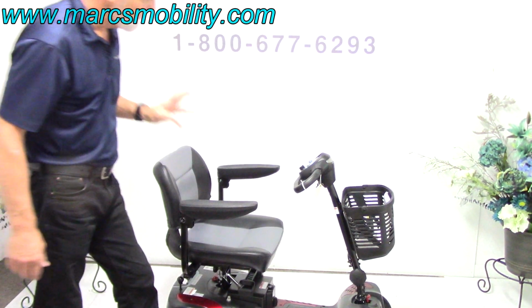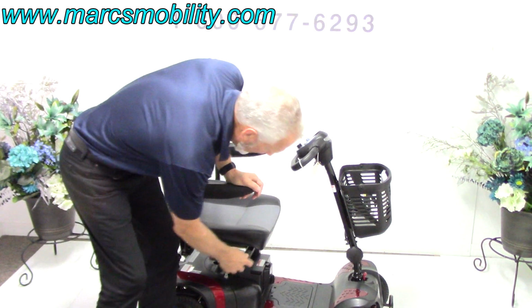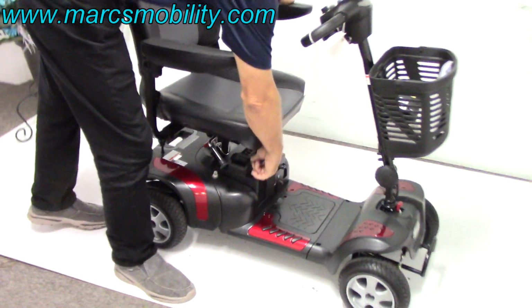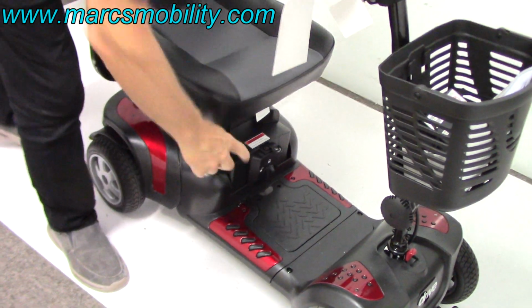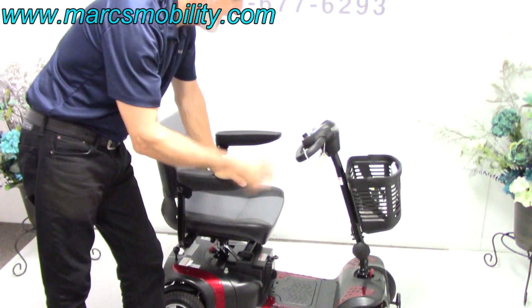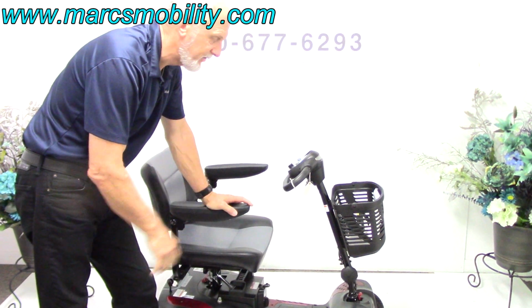Now also, if you want to charge this scooter in the house, you can just take the battery pack by itself into the house. On top of the battery pack here, you'll see right there, when you take the battery pack in the house, you have the same port that you had on the side here. You can charge it right here with your battery charger. So if you want to leave the scooter in the car, take the battery pack with you, you could just take it and charge it in the house.